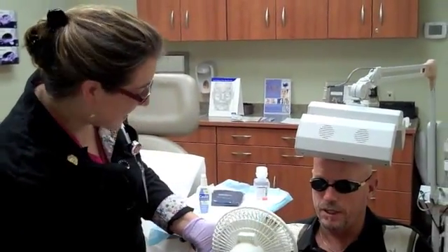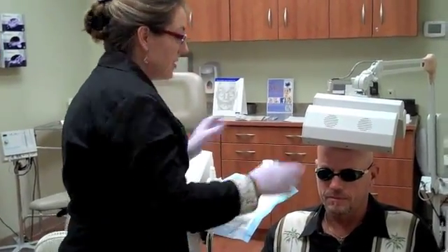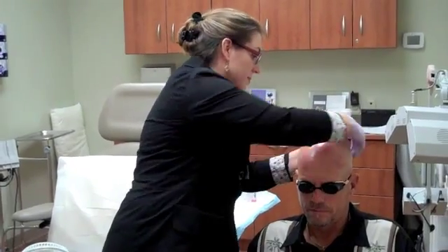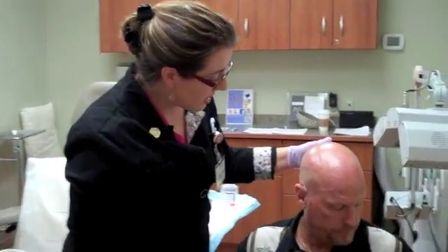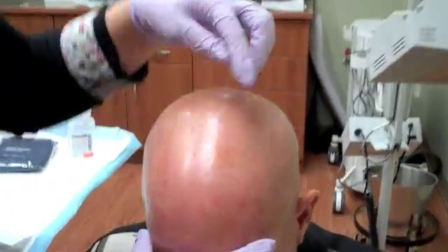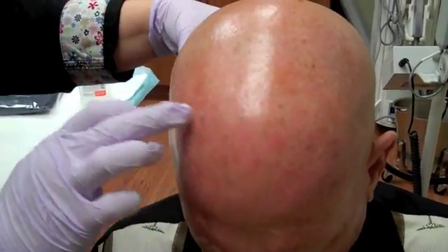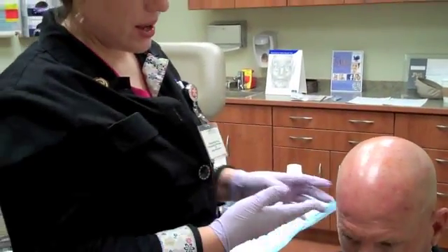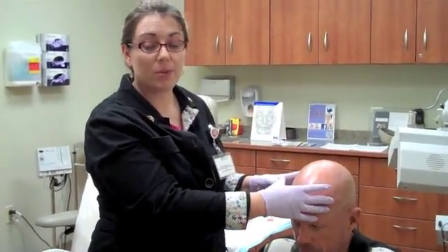Hey Mr. Stevens, how did you do? Very well, thanks. Not too much burning or stinging? Nope. What we are going to do now is take this light away from you and take those goggles off. Let's have the camera zoom in a little bit and just see how the head has turned a little bit pink, especially right through here. Usually the areas that are more pink or red are the areas with more sun damage and pre-cancer lesions.